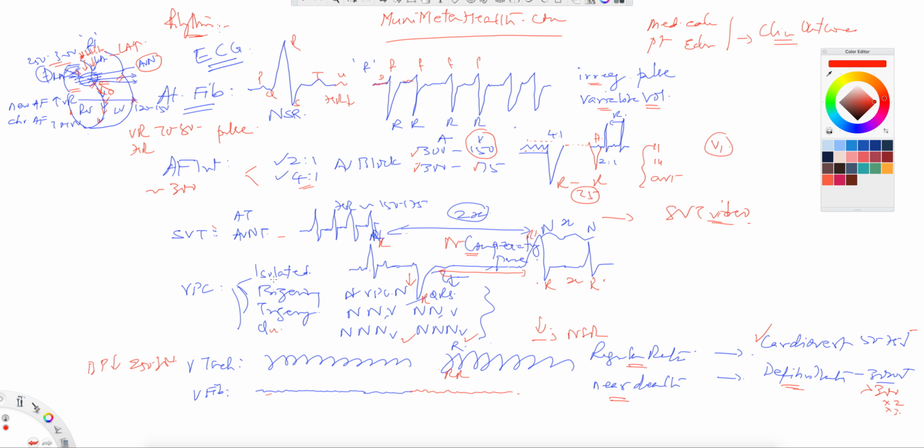That's an emergency. So in a nutshell, you've learned about atrial fibrillation, atrial flutter, SVT, VPCs, and of course normal beats. I think we have already talked about where the normal complex looks like this. But in general, most of these arrhythmias are arising from the supraventricular area, that means the atria, and of course VT, VTAC, and VF are arising from the ventricles here.